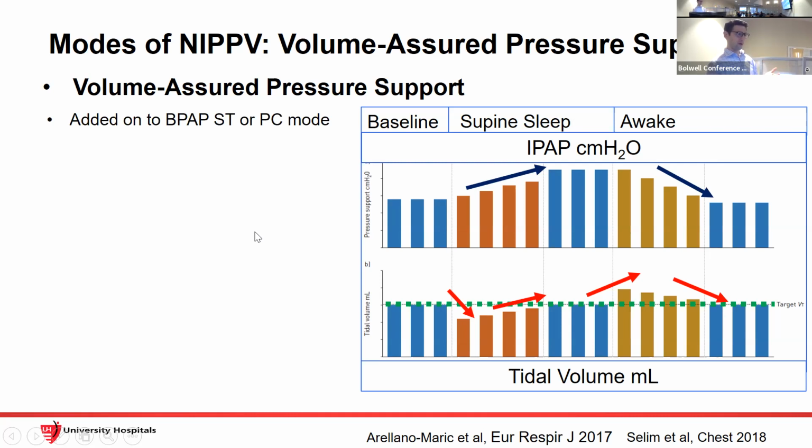So practically, what you do is you set an EPAP. Sometimes the EPAP can actually be an auto EPAP to make things a little more confusing, but it's got all the bells and whistles. To keep it simple, you set an EPAP, you set an IPAP range above that EPAP. So let's say your EPAP is 4, your IPAP will be 10 above to 20 above, let's say.